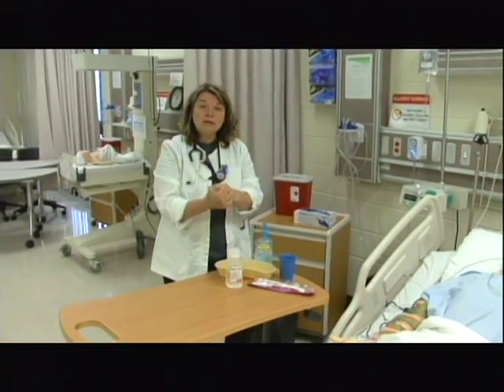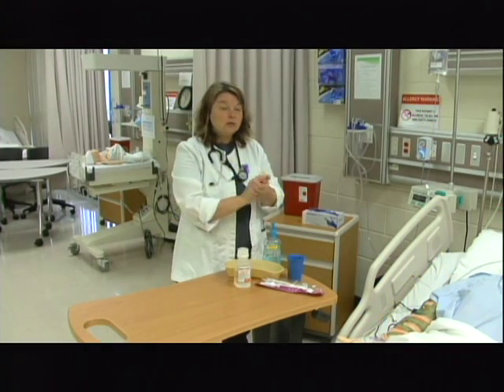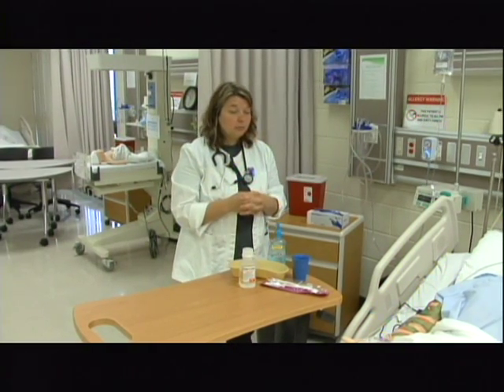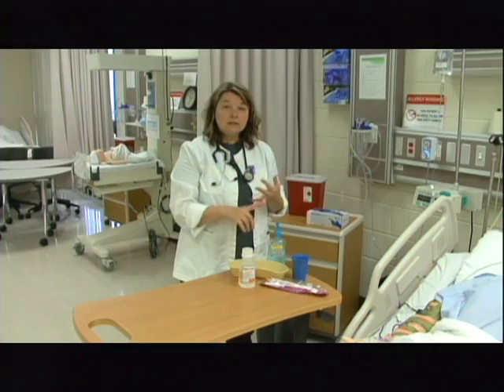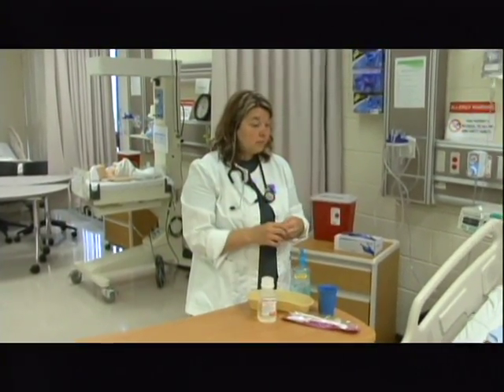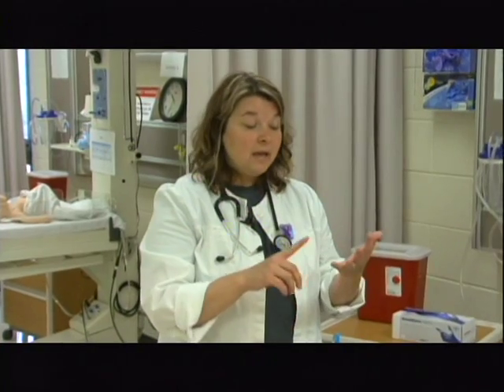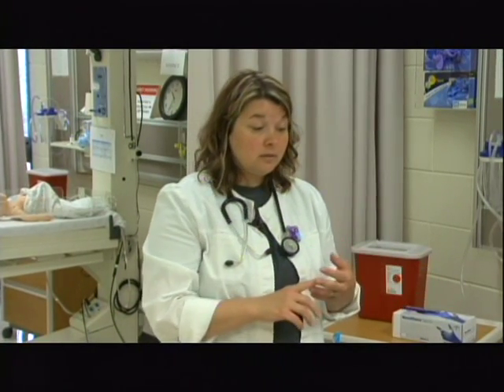Whenever I leave the room, I need to document the procedures performed, how Mr. Smith tolerated the procedure, the color and consistency of any secretions obtained, and how his pulse ox did throughout the procedure. I also need to reassess him when done to see if his breath sounds have changed both anteriorly and posteriorly, noting his pulse ox, respiratory rate and effort, and any change in how the procedure went for him.